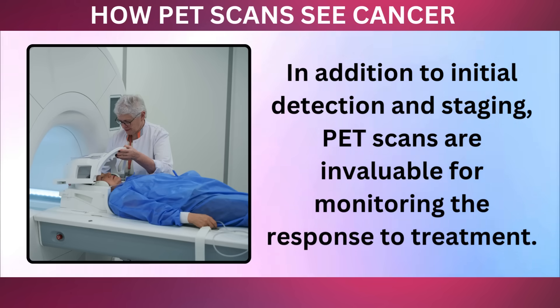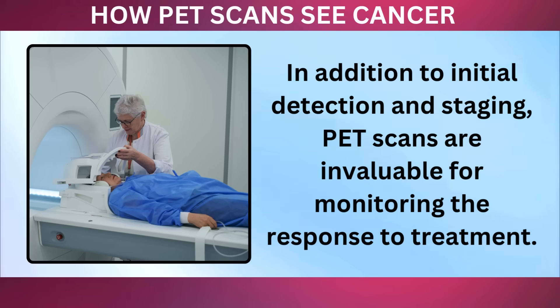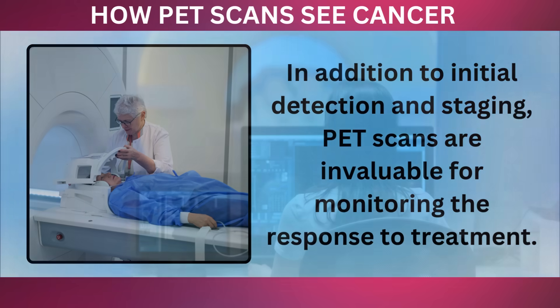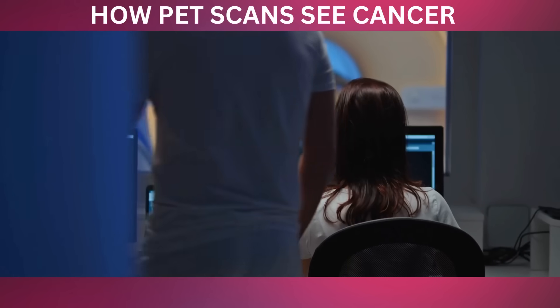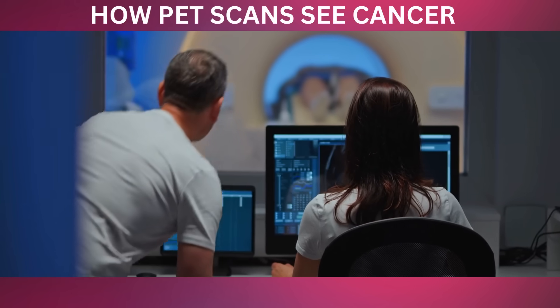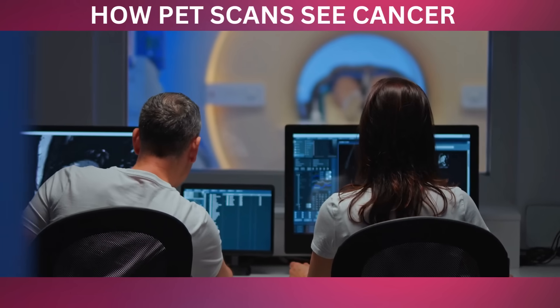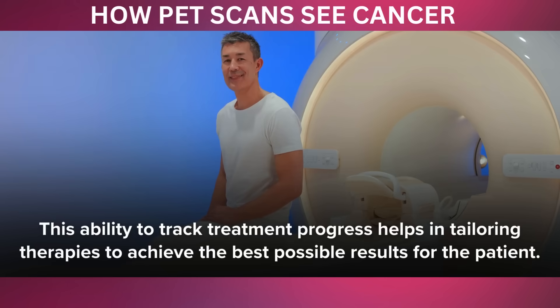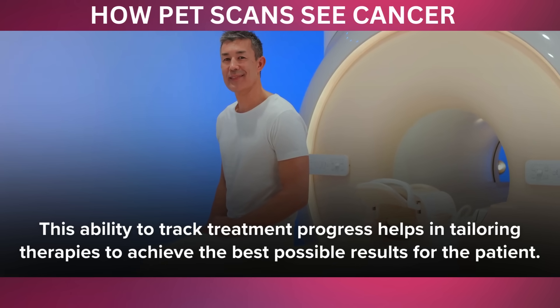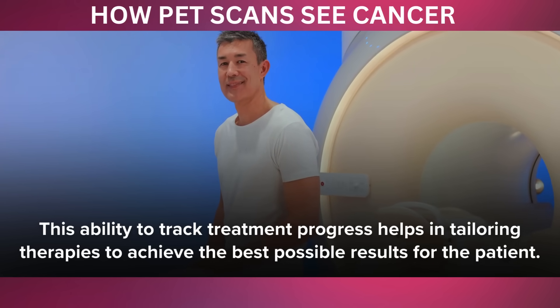In addition to initial detection and staging, PET scans are invaluable for monitoring the response to treatment. By showing changes in metabolic activity over time, doctors can assess how well the treatment is working and make necessary adjustments. This ability to track treatment progress helps in tailoring therapies to achieve the best possible results for the patient.